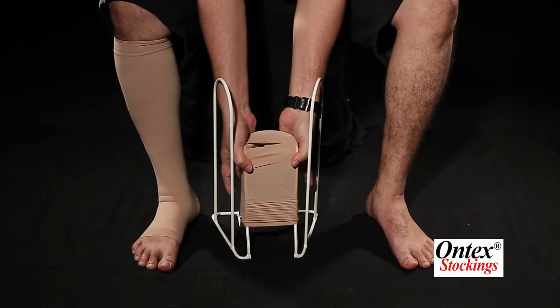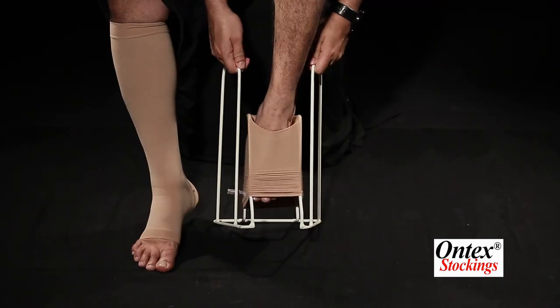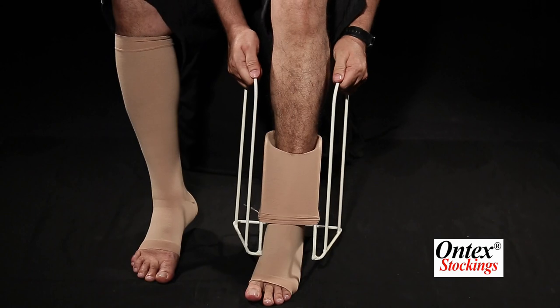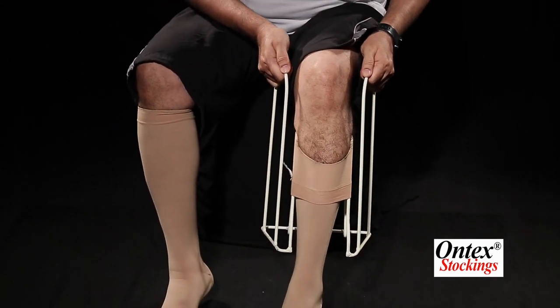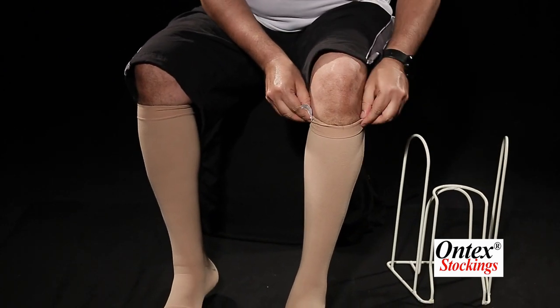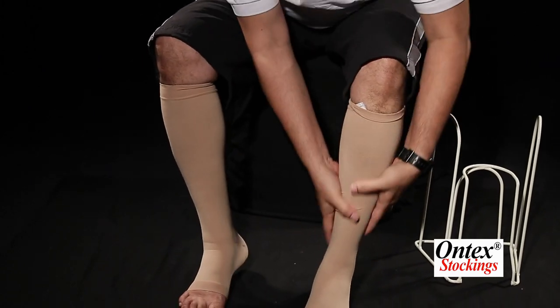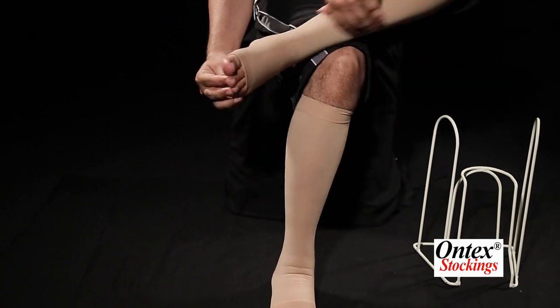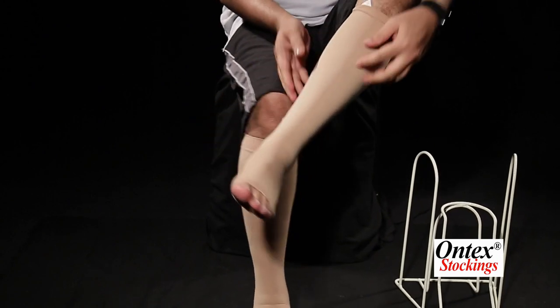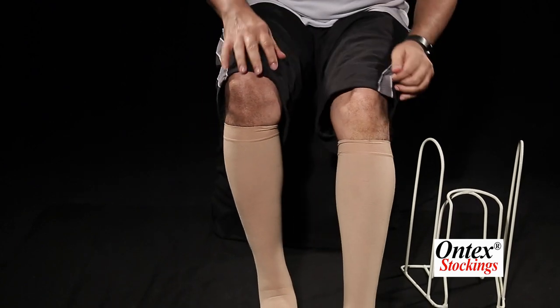Now you can put your leg inside, gently insert it and put your foot down, then gently pull it up. That's it. Now just smoothen out any wrinkles and make some slight adjustments. That's it.